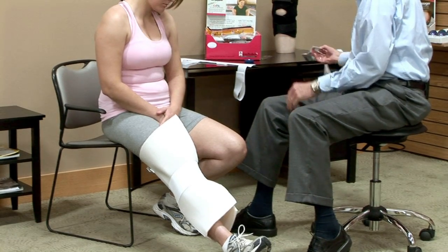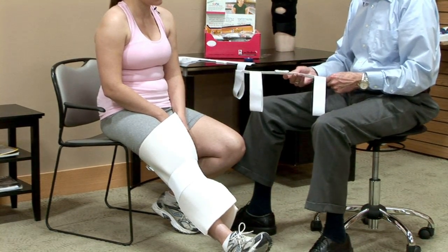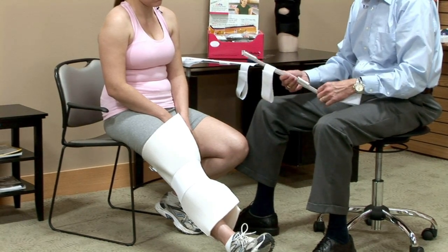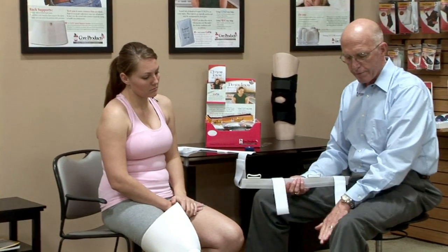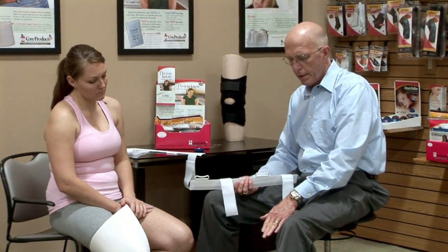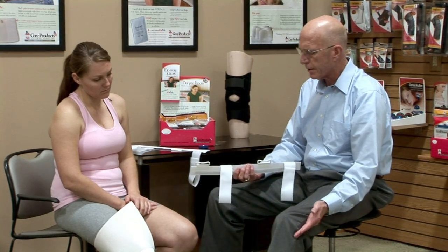Now we can take these sidebars, and that's going to provide the actual immobilization for the leg. These are to be put on the very lateral and very medial of the leg, not towards the front or towards the back. It can only support the knee if it's on the very inside and very outside of the leg.